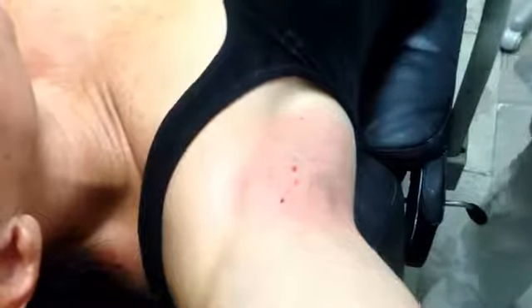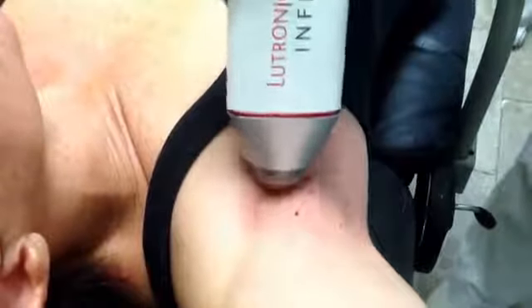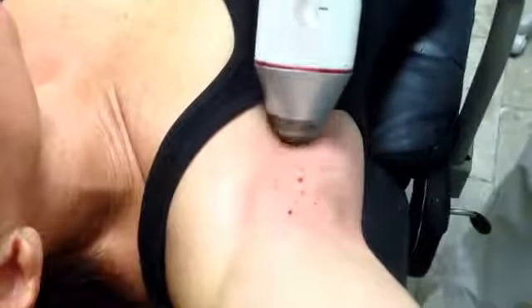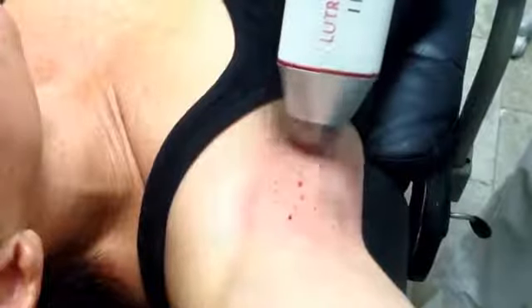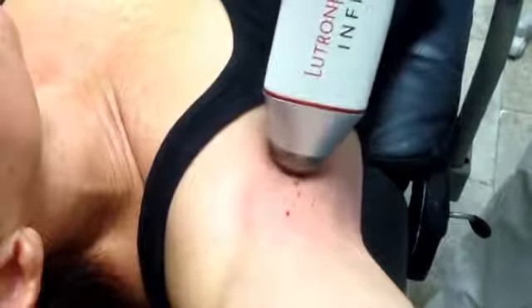Now we're changing to a different level and treating a little more superficially, so we'll show you that a bit more. As you can see, this procedure goes very quickly — it probably takes around 10 minutes at most for one underarm.